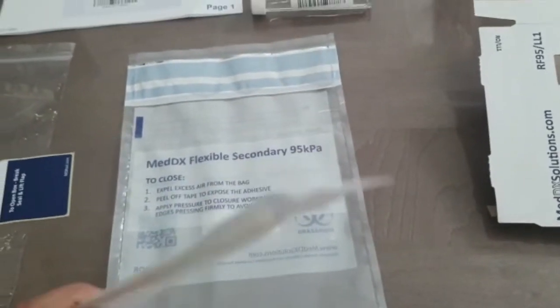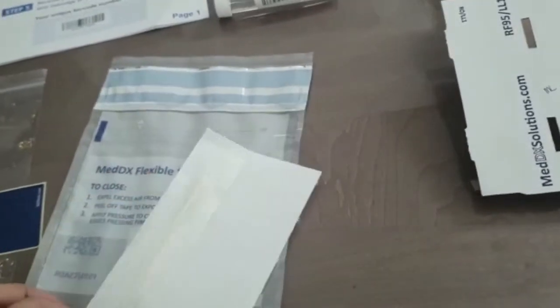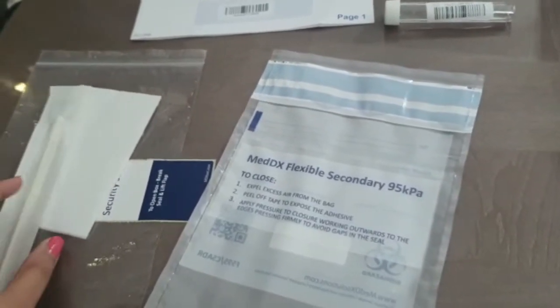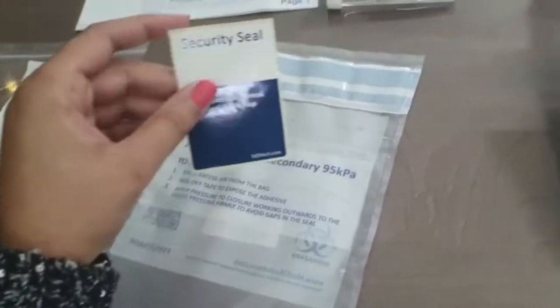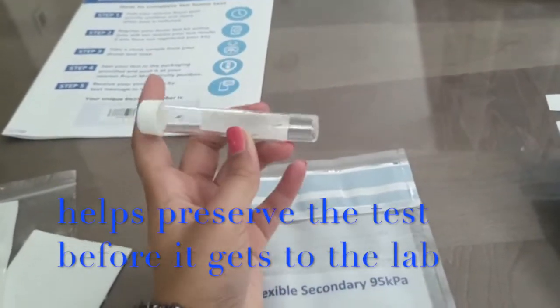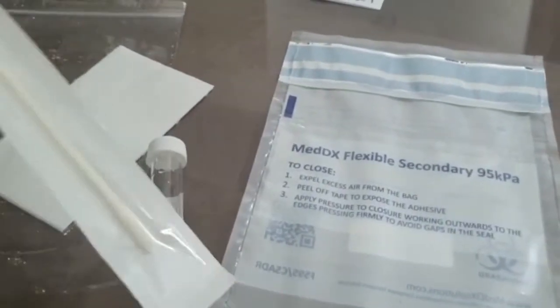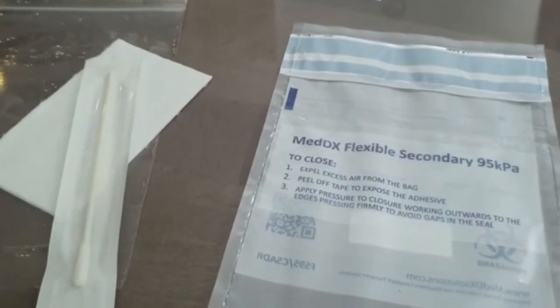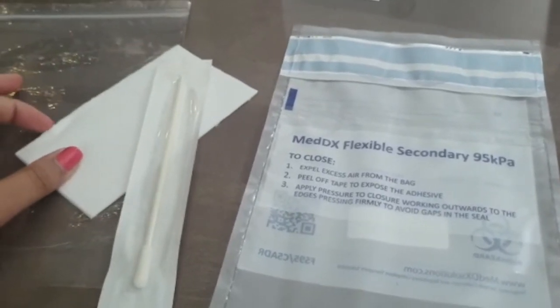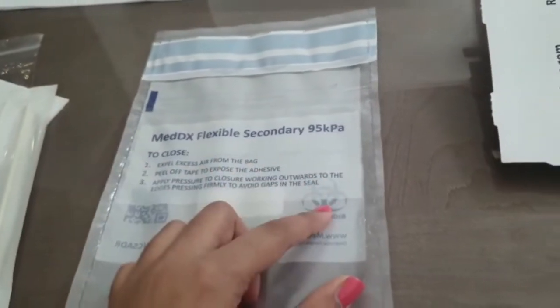I thought I would walk you through everything they send. This is the swab, which you put at the back of your throat and on your tonsils, and then you put it up your nose. Then you've got a paper towel which you put with the swab, and then you put it in this plastic container. You've got a sticker that says 'security seal' for the box, and then you've got this test tube with liquid in it. You snap off the end of the swab and leave it in the test tube with the liquid, then you put the test tube in this bag covered by a cloth, and then into this biohazardous bag.